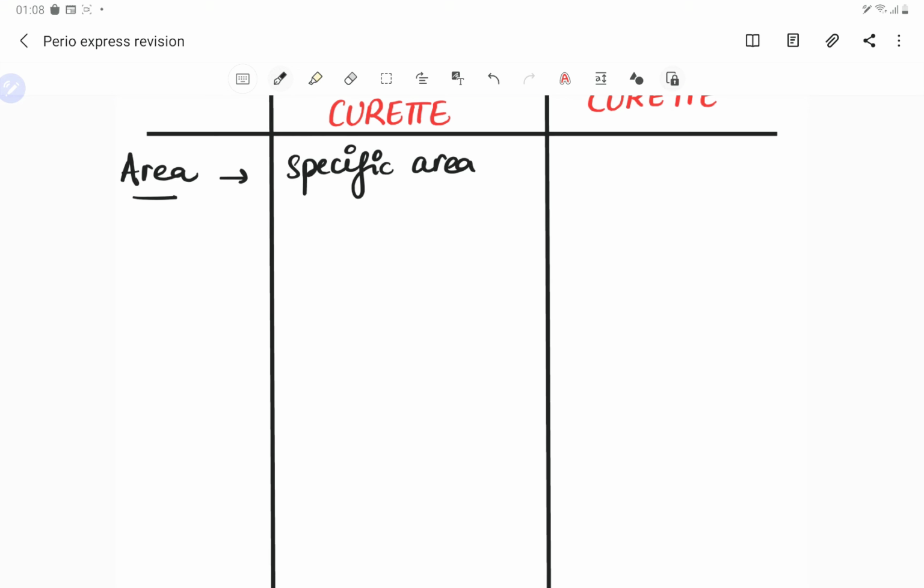We have covered that 1, 2, 3, 4 we use for the anterior teeth, and 5, 6 we use for the premolars, then 7, 8, 9, 10 for the posterior teeth, facial and lingual region. 11, 12 you remember 1, 1, then combine it and form the M. So 11, 12 is for mesial posterior.